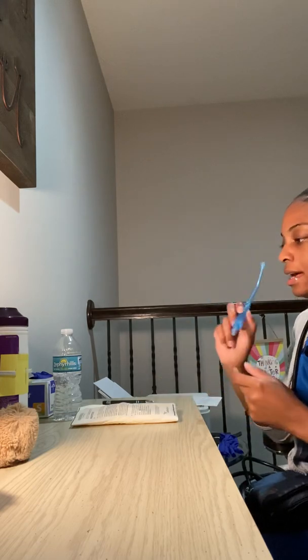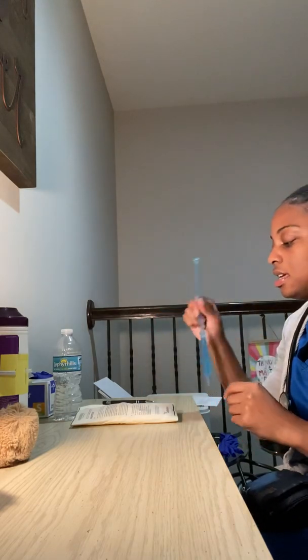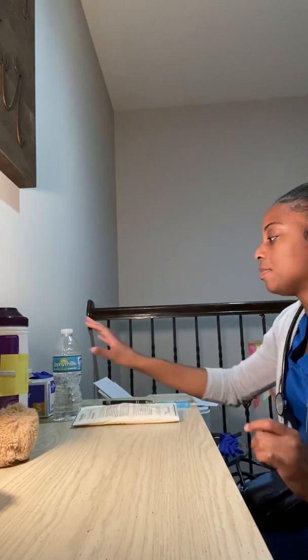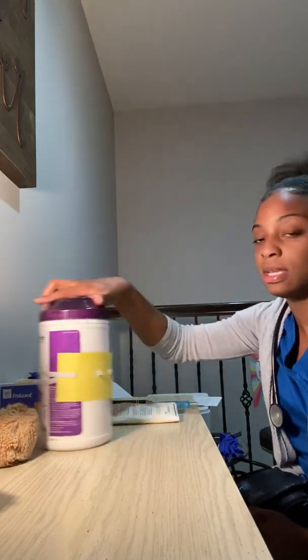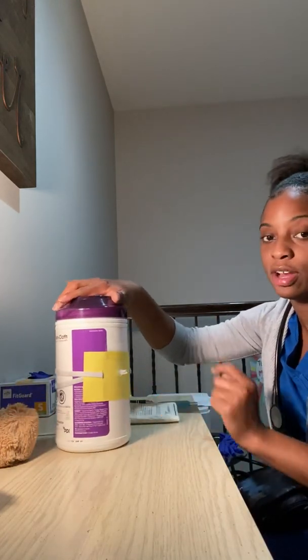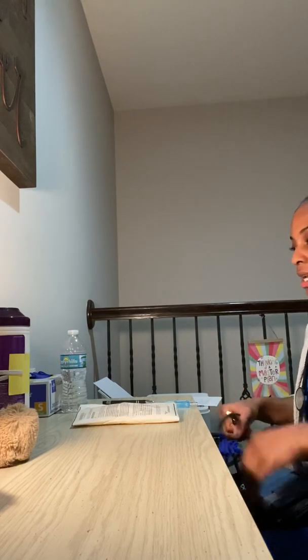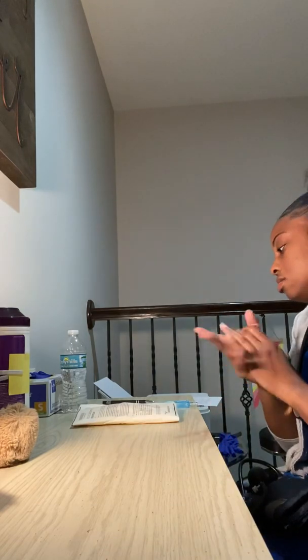So I'm gonna wash my hands. I've let my patient know exactly what it is I'm going to be doing, and we can go ahead and proceed. So I would wash my hands. I've got my suctioning that's connected here. I've got my trach suctioning kit, some extra gloves, my sterile water, and then obviously my patient with her trach. Okay, so I'm gonna go ahead and wash my hands.